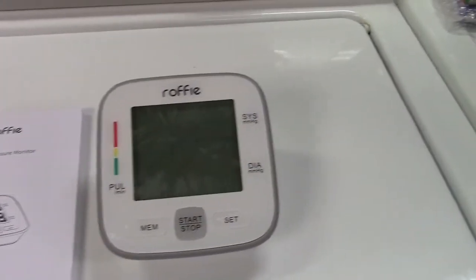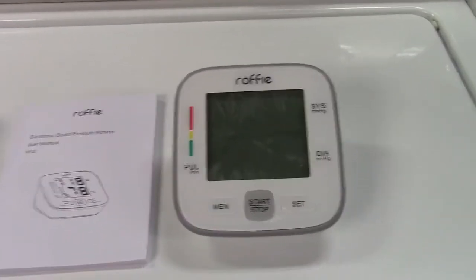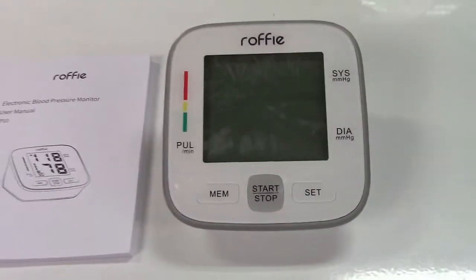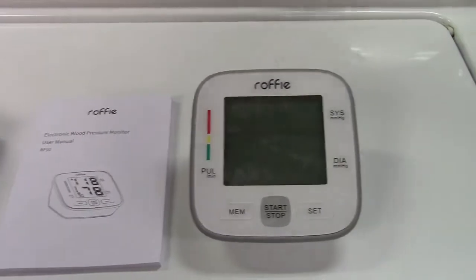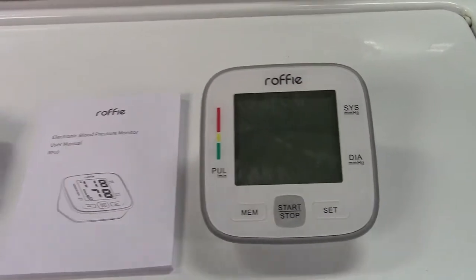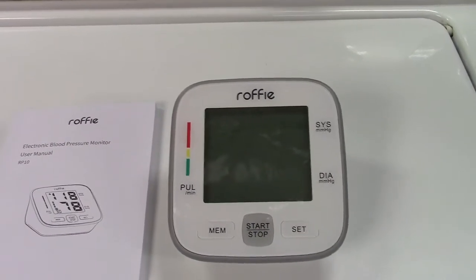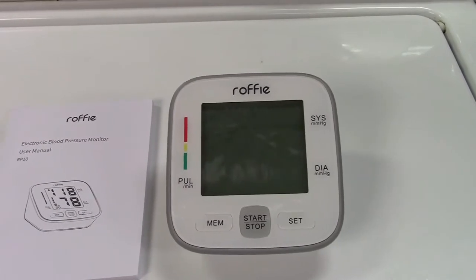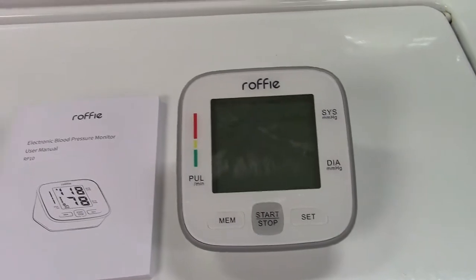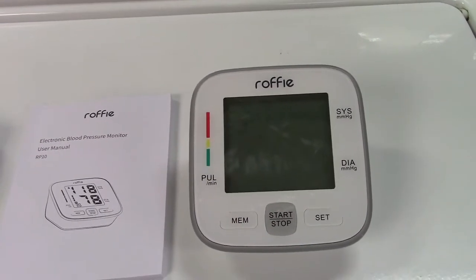This is a blood pressure monitor that reads your blood pressure like any other blood pressure machine. It gives you the systolic and diastolic readings and also shows your heart rate. The screen has very large numbers and it's backlit in orange, so it's very easy to read. The monitor stores 90 readings, and you can set the time and date so it tells you when those readings were taken.